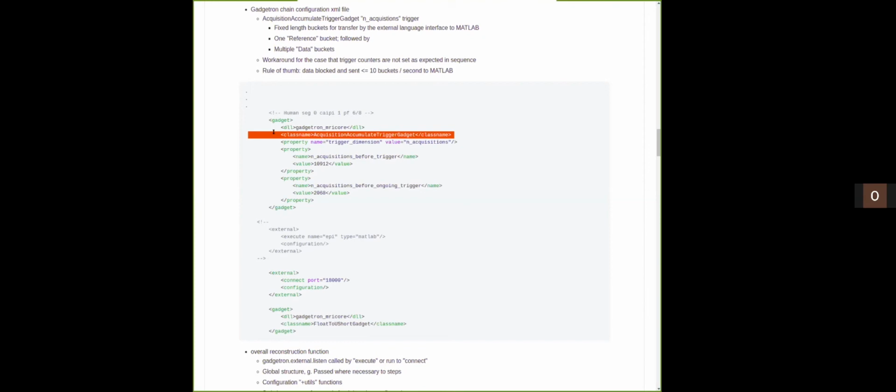I think this is 8 times accelerated data, so it will be 8 times larger than it needs to be, and unfortunately that's too big an overhead for getting the data in real time to Matlab. So instead I am transferring buckets, and I think Aurélien also didn't have time to show, but in their talk there is another example of using bucket transfer directly to Matlab.